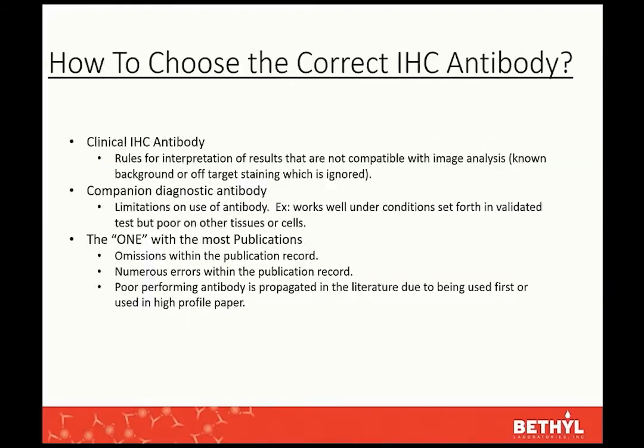So how do you get to that choice of how do you choose an antibody? Commonly, what we hear from our customers is that they look to see which antibody is used in the clinic, whether it's a standard clinical diagnostic test or a companion diagnostic test.